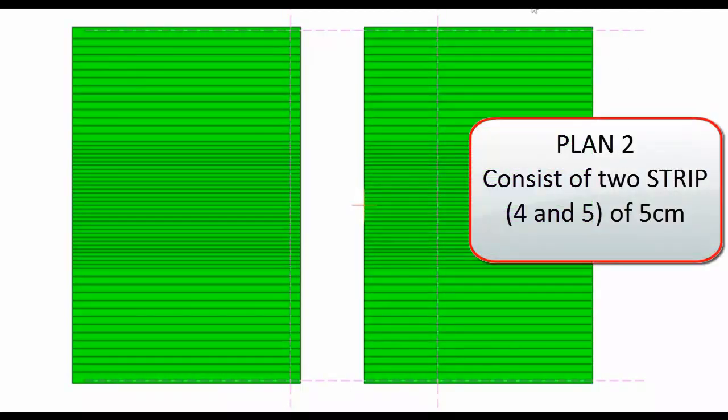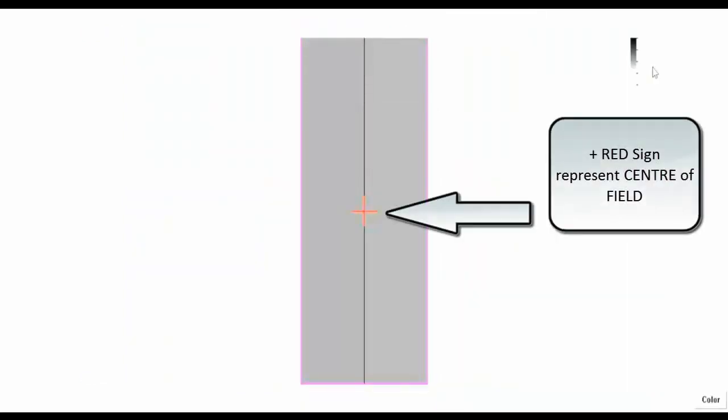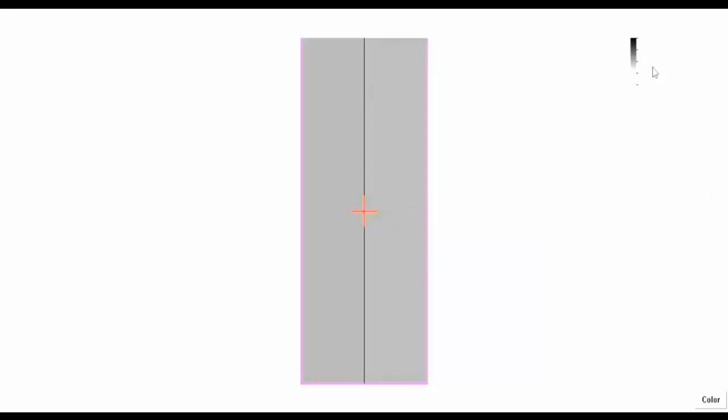Next, plan 2 is exposed, in which strip 4 and strip 5 will be exposed. Strip 4 is exposed with the help of the MLC — the jaw is now fixed — and then strip 5 is exposed. When you see this exposed region of the film, the plus sign represents the center of the field and the two blackened regions represent the 5 centimeter wide strips.